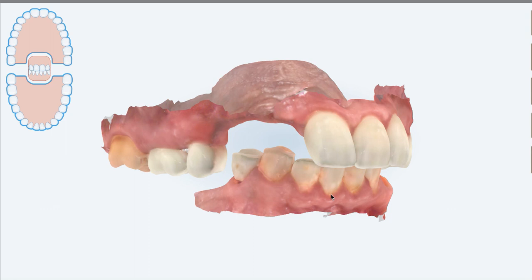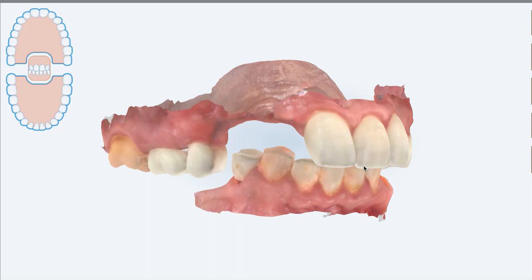So I use a variety of these. The point is, you want to have the patient captured vertically during the jaw relation, during the bite. So just a bite registration at an open vertical position. Well, how do you get them there? Well, what do we do in complete dentures? We use wax rims. So I will sometimes use soft wax and I will place it between the teeth to approximate a good position at which I'm happy.